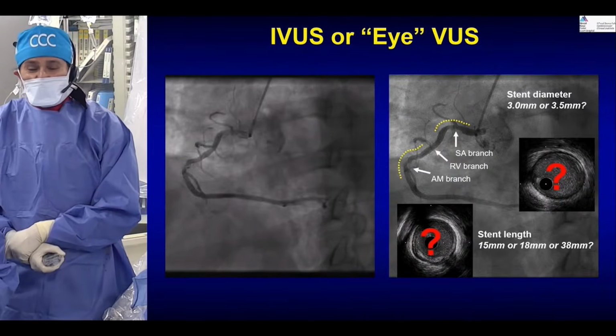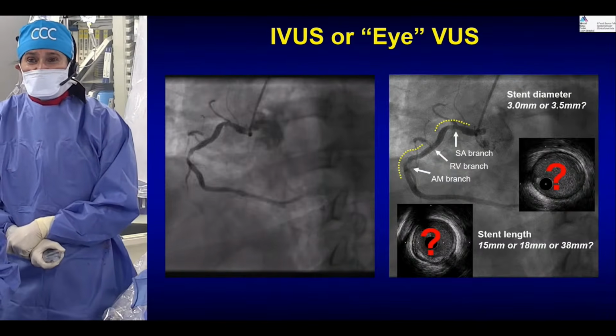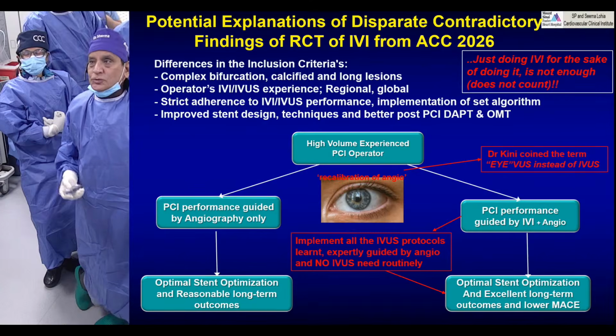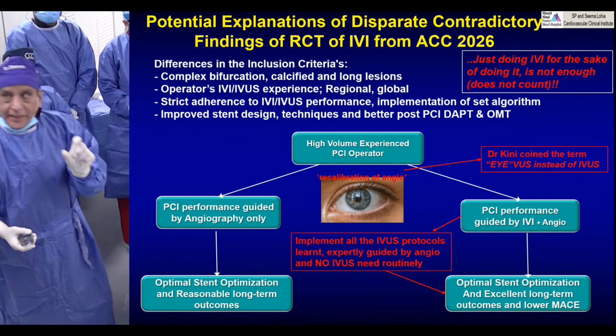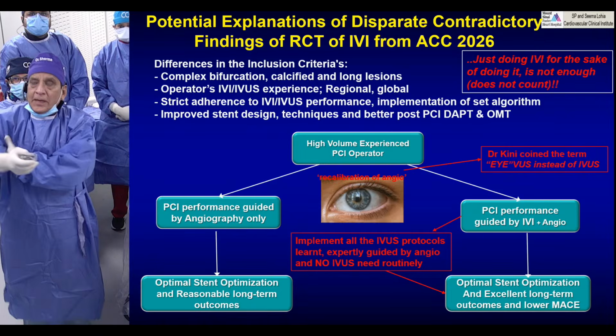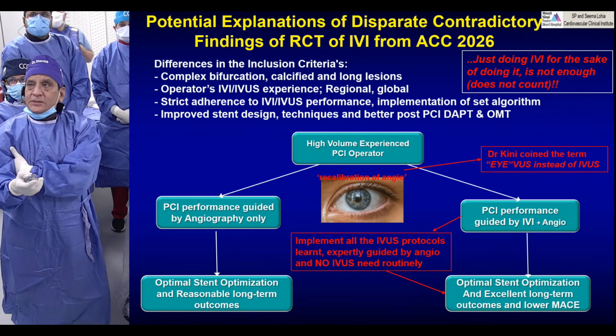We used angiography, and everything was done using angiography. So just basically to say that now, imaging made us better angiographers. So that is what I put together. Samir, any question on that point?